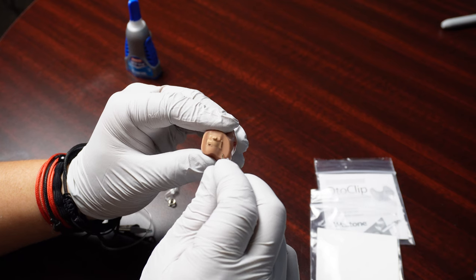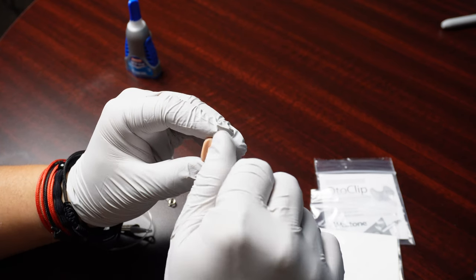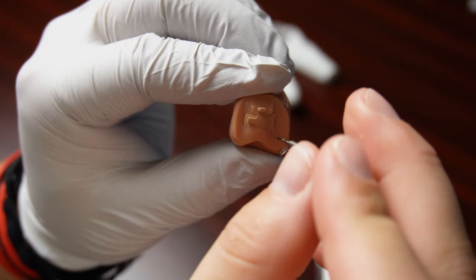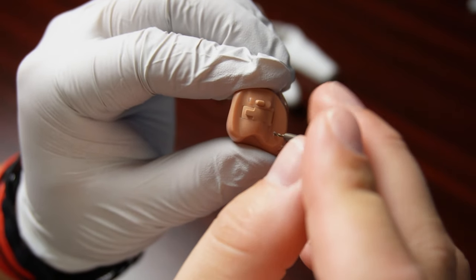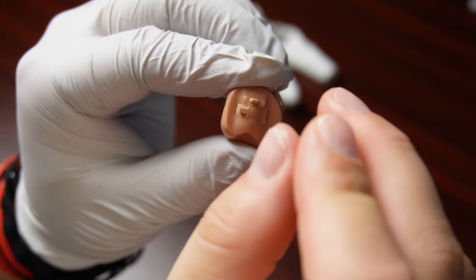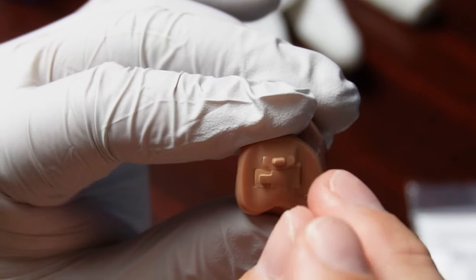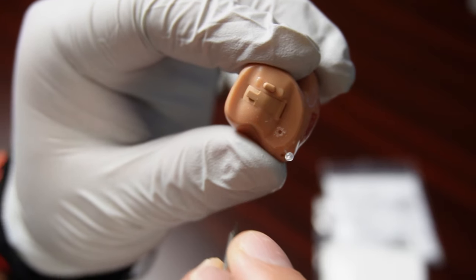Now, this part may look hard, it may look daunting, but it is really not, folks. It's very easy. Just keep the drill in one spot. Once you get a little notch started, you won't have a problem keeping it in the same spot, and just slowly twist the drill. You don't have to go really fast. Take your time. It's going to take a couple of minutes, just one turn at a time. Just start turning it and you will see some of the plastic coming out until you finally poke a hole through it.